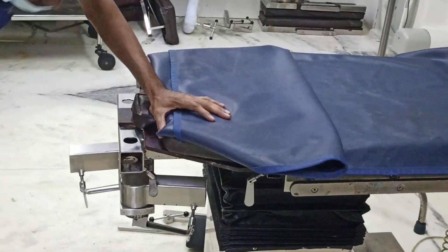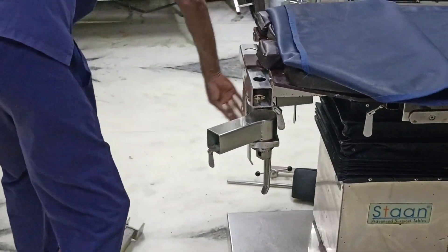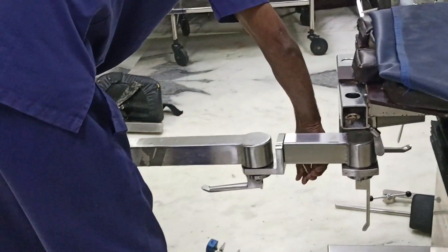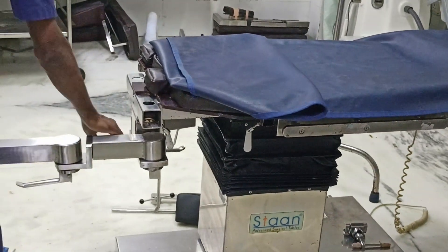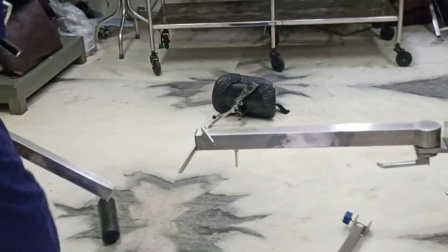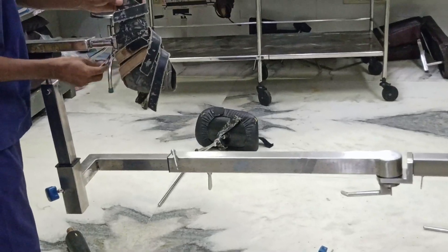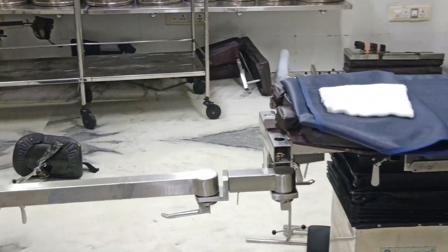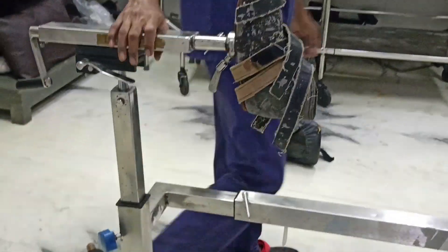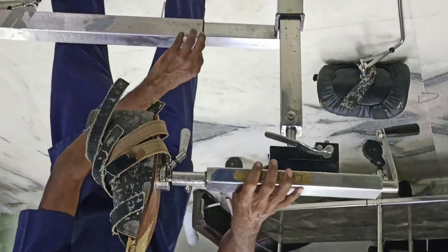Now, according to the side of the fracture, we have to make the arrangement for that side — the fractured side. This attachment is added to give traction. This arm is used to hold the foot. We hold the foot and tighten these screws after fixing the foot to the foot board.